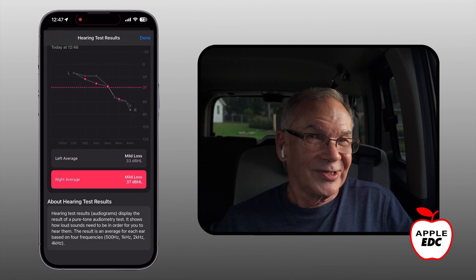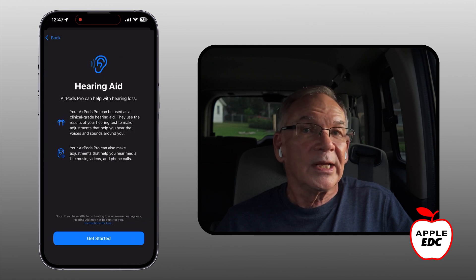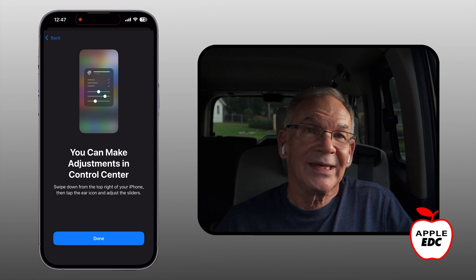When you're done reviewing your results, tap 'Update Hearing Aid' to get started with turning the hearing aid on and making final adjustments. It shows you a reminder screen to let you know that it might take a little time to get used to your hearing aids. Then it reminds you that you can control them through the control center on your phone. You get to the control center by swiping down diagonally from the top of your phone. For your AirPods Pro 2 to show up in the control center, you need to be wearing them.